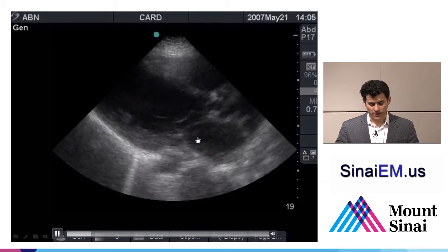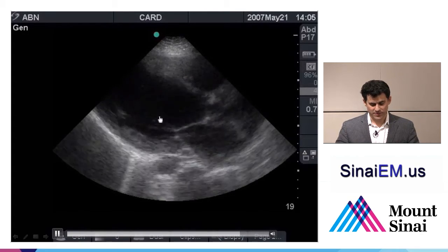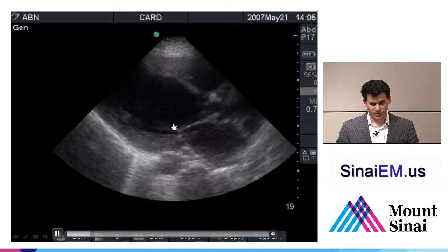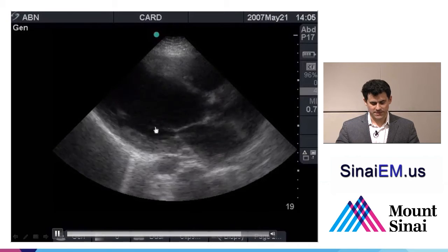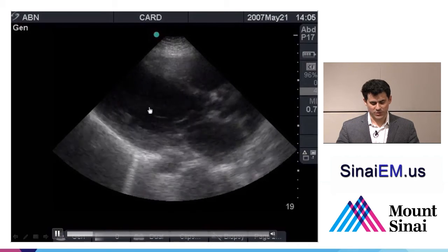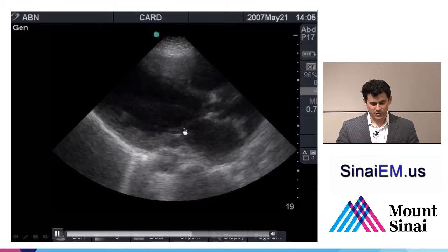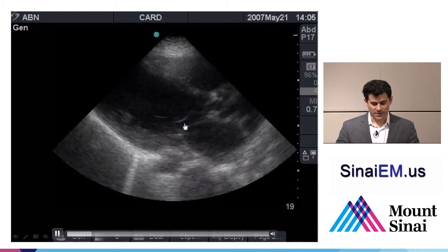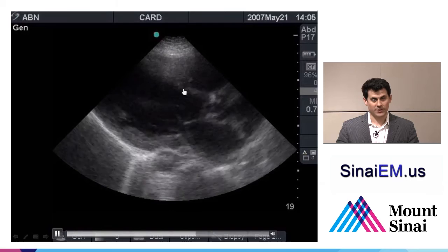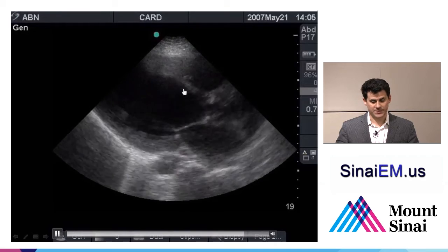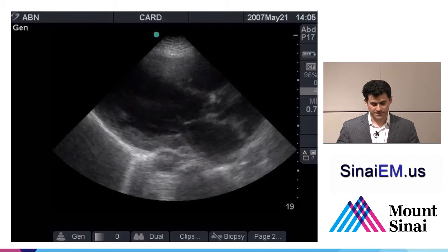Here as well we see poor contractility. There's a little bit of movement back and forth, not terribly organized, and not a lot of squeeze towards the center of the chamber. Even though it's moving a little more quickly, the mitral valve is not getting very close to the septum — another example of poor contractility.